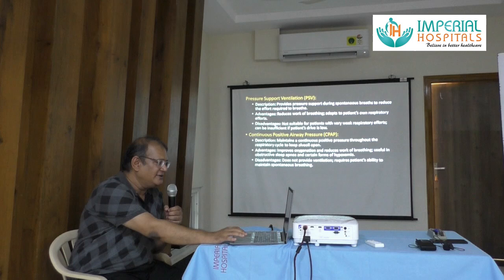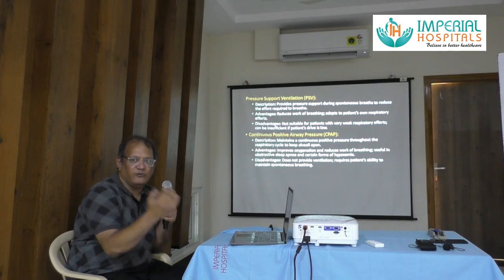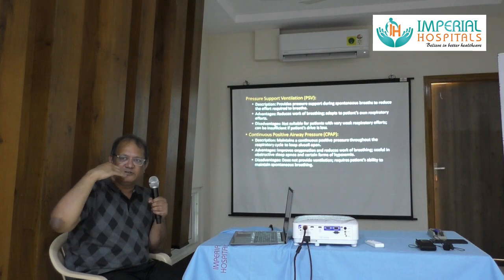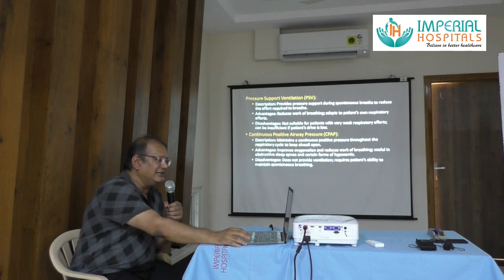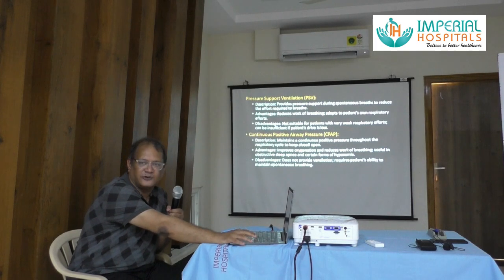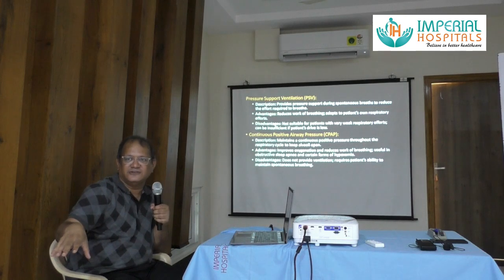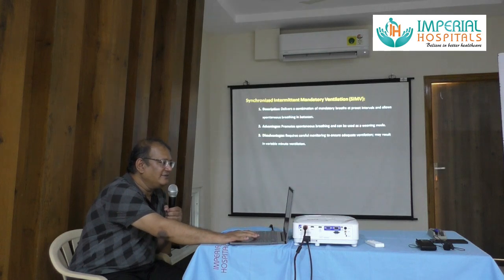Advantages is it improves oxygenation, reduces work of breathing, and this is very useful in obstructive sleep apnea and certain forms of hypoxia. Like in OSA, what happens is the soft palate will fall down and will obstruct. So continuous positive airway pressure, at least when the patient initiates a breath, will push the palate upwards and so it will clear it. Disadvantages is it does not provide ventilation and requires the patient's ability to maintain spontaneous breathing. One of the absolute indications for starting a patient on CPAP is that the patient has to be conscious and the patient has to initiate breathing. This is the reason why.